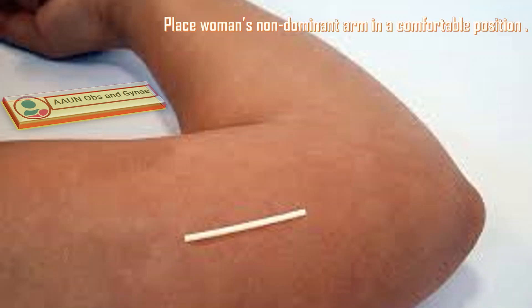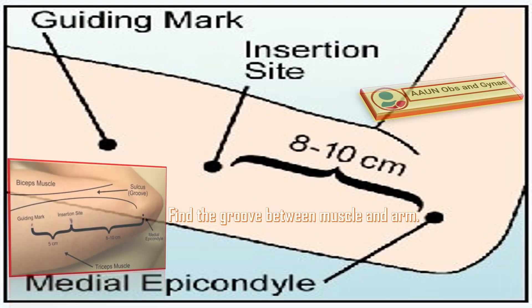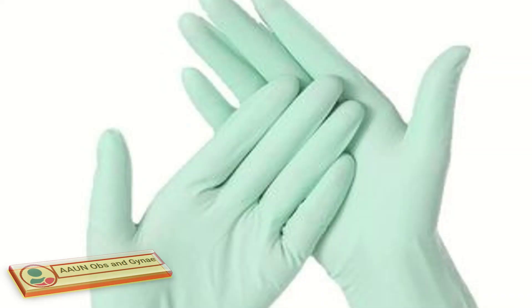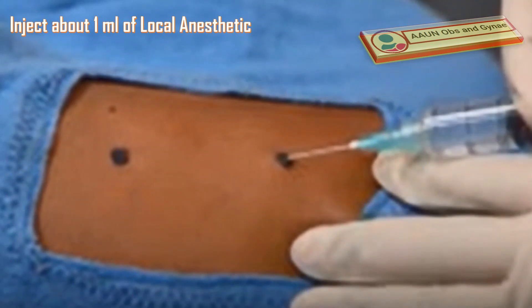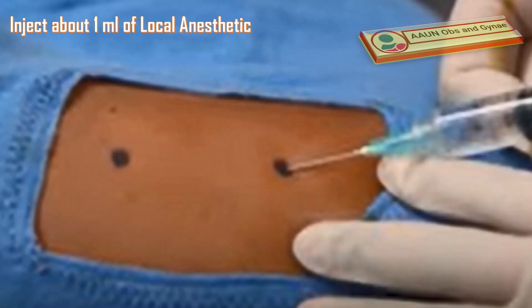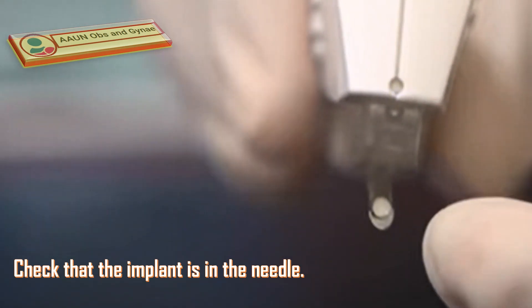Place the woman's non-dominant arm in a comfortable position, flexed at the elbow. Find the groove between the muscle and arm. Measure 4 fingers from the elbow bone, or about 8–10 cm above the medial epicondyle. Put sterile gloves on. Apply antiseptic solution on the area where Nexplanon is to be inserted. Inject local anesthetic of about 1 ml along the area where Nexplanon will be inserted. Remove the needle cover of Nexplanon and check that the implant is in the needle.